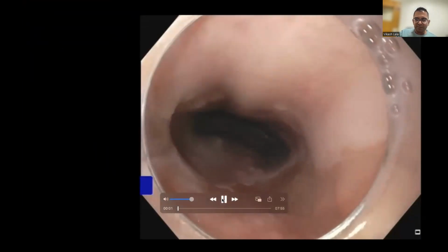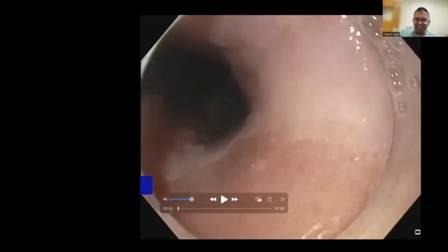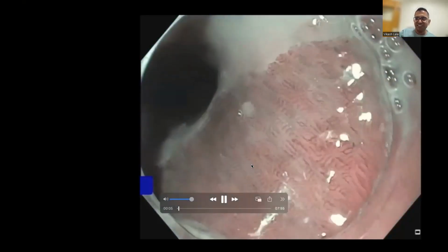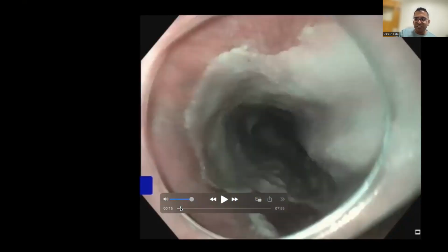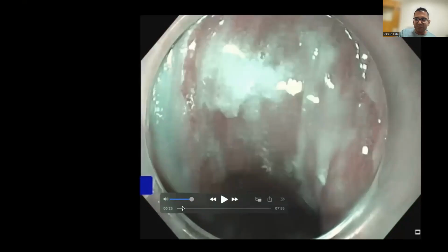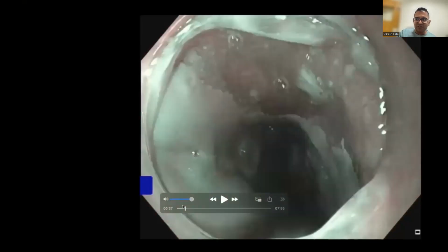So I'm going to skip the first part. I think the first part is an interesting discussion, but a completely different discussion altogether. And maybe if we have time, we can talk about it. But this patient had a massive inlet patch. This is just below his upper esophageal sphincter, and you can see quite a big inlet patch. Argument here is, is this just an inlet patch or is this actually related to his Barrett's?